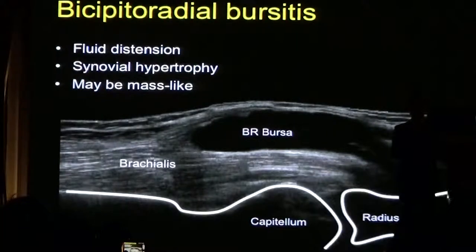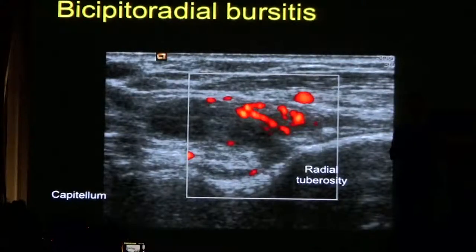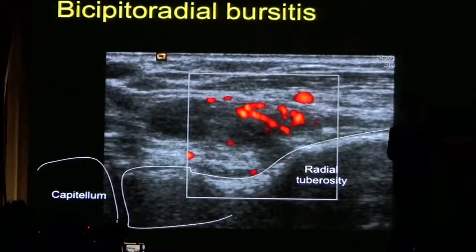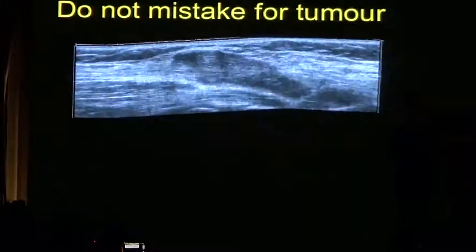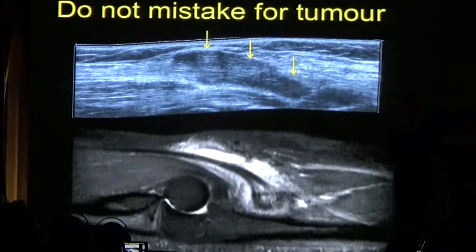In certain conditions such as rheumatoid arthritis, you can have a bursa that is distended with solid material due to synovial hypertrophy. It's important not to mistake this for a tumor around the biceps tendon. Here is another example of a distended bicipitoradial bursa with synovial hypertrophy, along with the corresponding MRI showing synovitis around the tendon, which is partly torn.